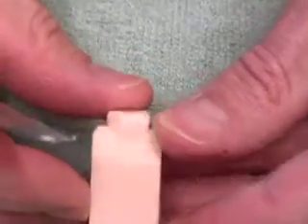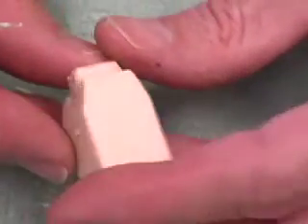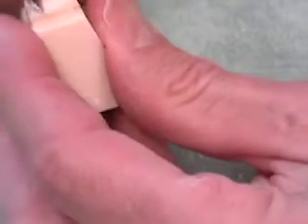We've kind of scooped out our gum line right along there. Now from our mesial view, we're going to come and put our V in the center.